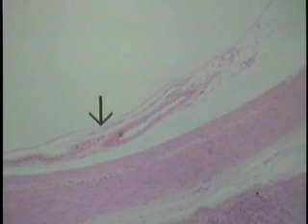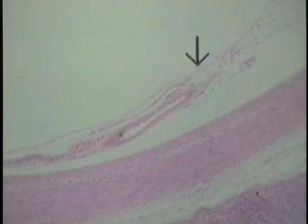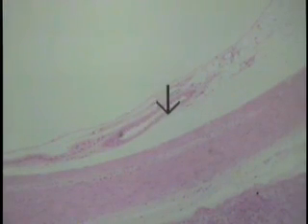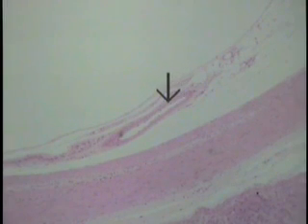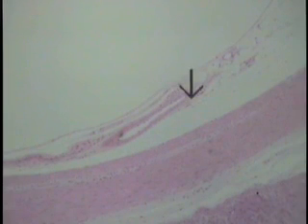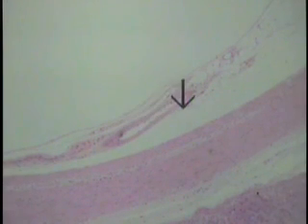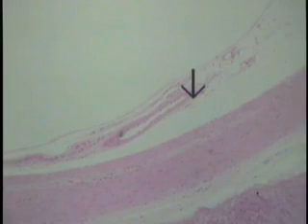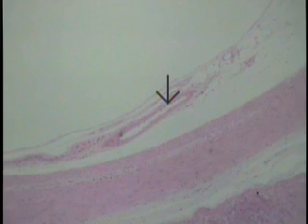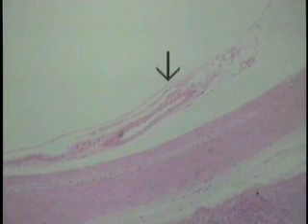It is this surface at the tip of the pointer that is going to be lined by a mesothelium, a form of simple squamous epithelium. And in this particular field, there's a small artery present here. Even at this scanning power, one can make out little dense nuclei. This would be the endothelial lining, another form of simple squamous epithelium specific for the cardiovascular system at this particular location. Now let's look at these at increased magnification.